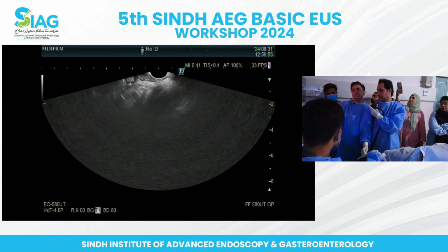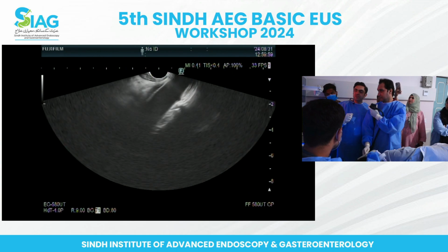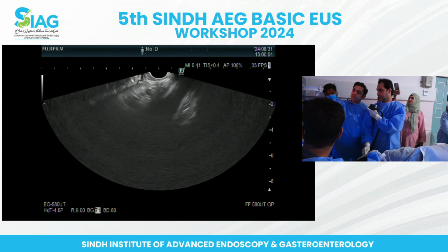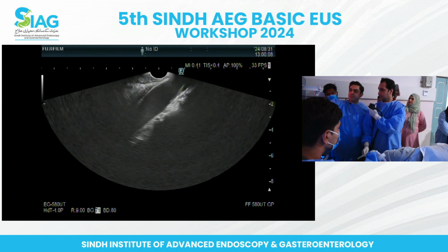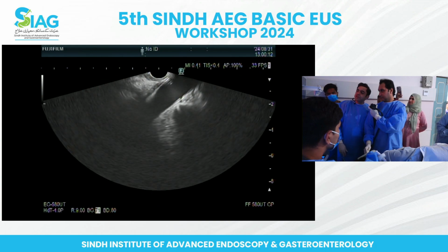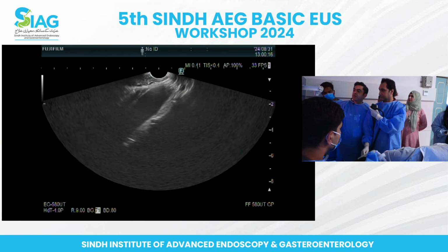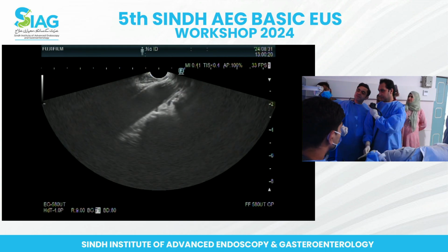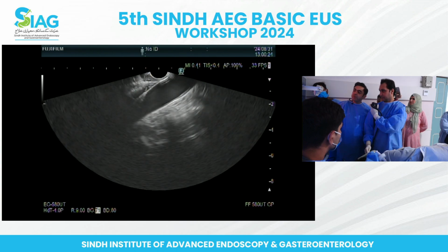So it's like Dr. Gayas was saying, it's a dynamic scan. So it's not one place you just need to stay in. So you can see your aorta. Just bring it into the landing position, coming all the way from the sign of this F going downwards in an angle. And that will be your home station. Like that. So yes, excellent. That's a very good position for it. Again, just move it a bit dynamically so that you can see the top and the bottom of it. Just move around, play around with it a bit.